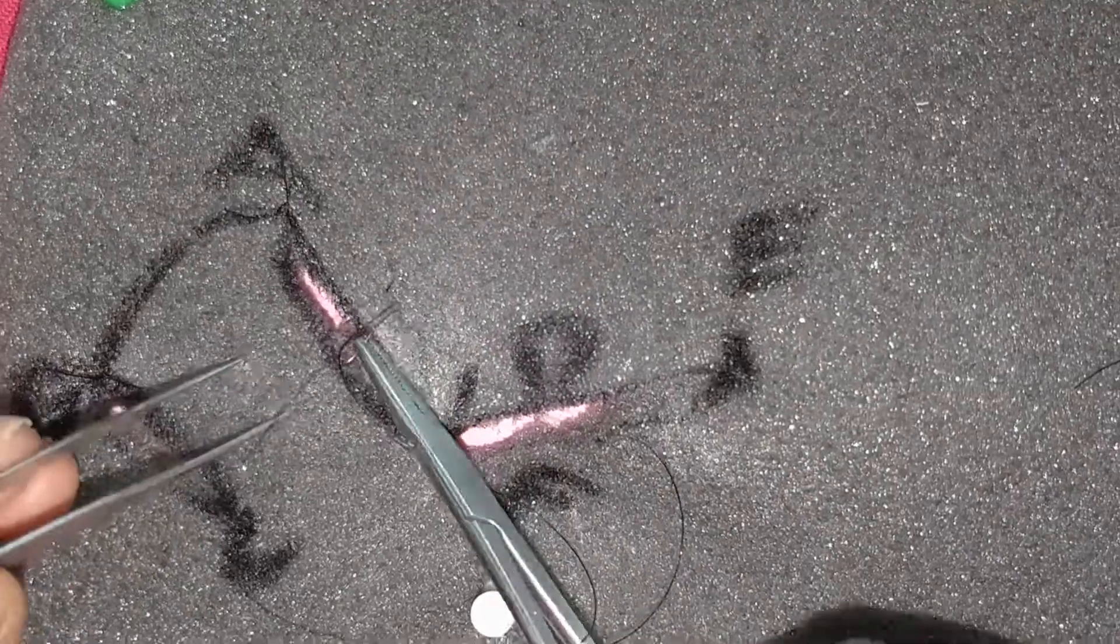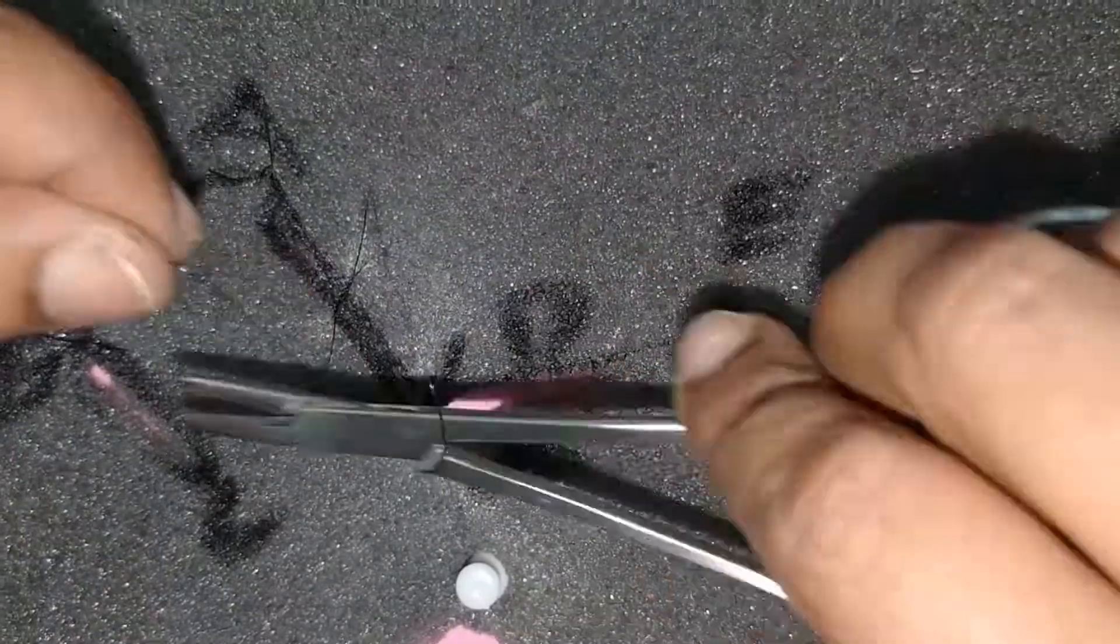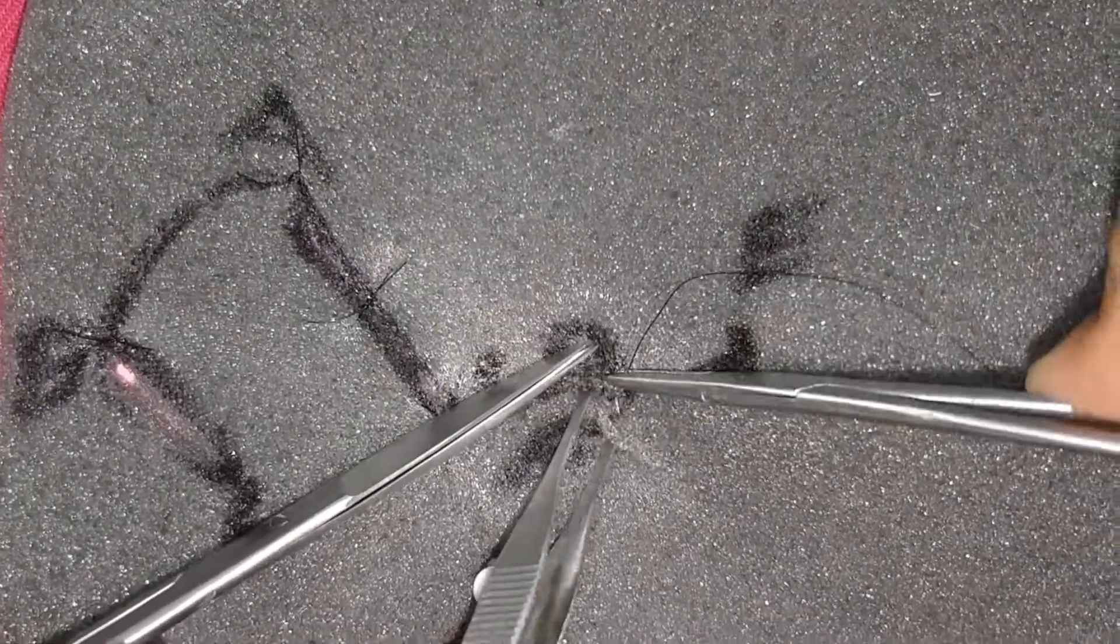After suturing the leading edge of the flap, the donor site must be closed. This can be done by making use of the laxity of the tissues. That is why selecting the side from which the flap is harvested is very important.